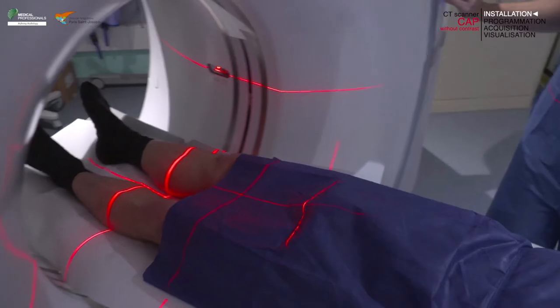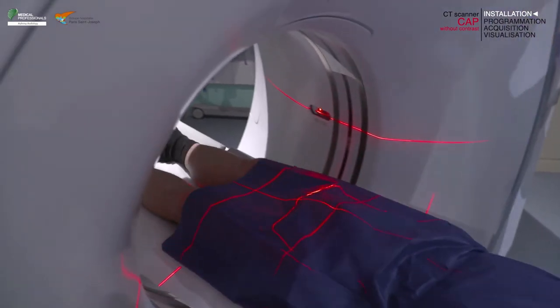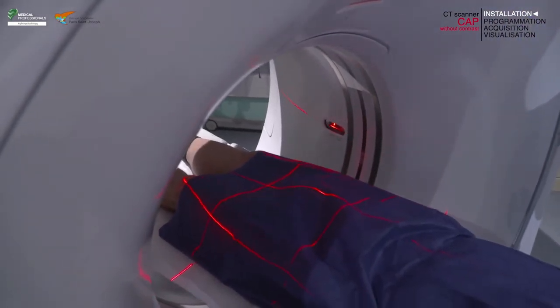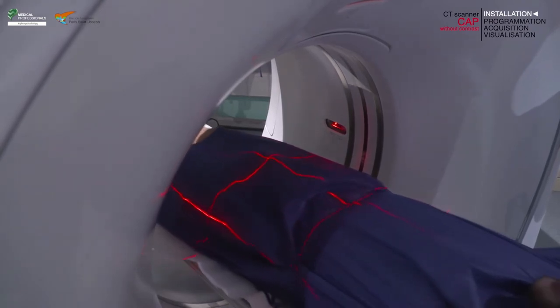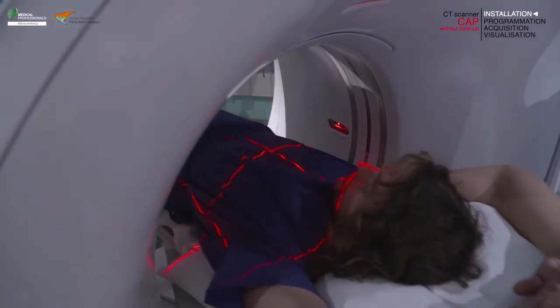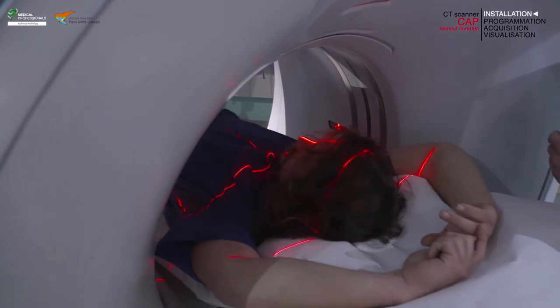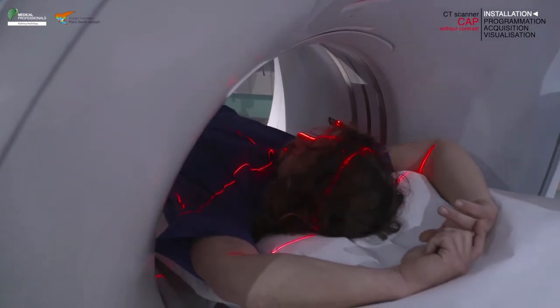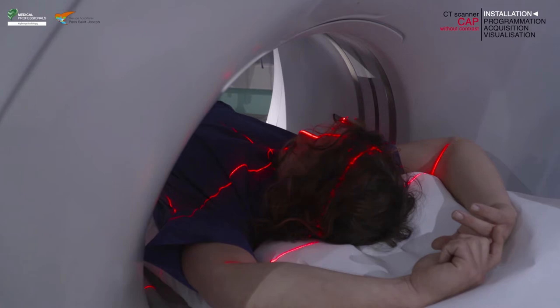Center the internal axial plane laser light on the appropriate landmark. Here we use the jugular notch of the sternum. Make sure that the lateral laser light is set at mid-thickness of the chest and that the longitudinal laser light is placed on the median sagittal plane.